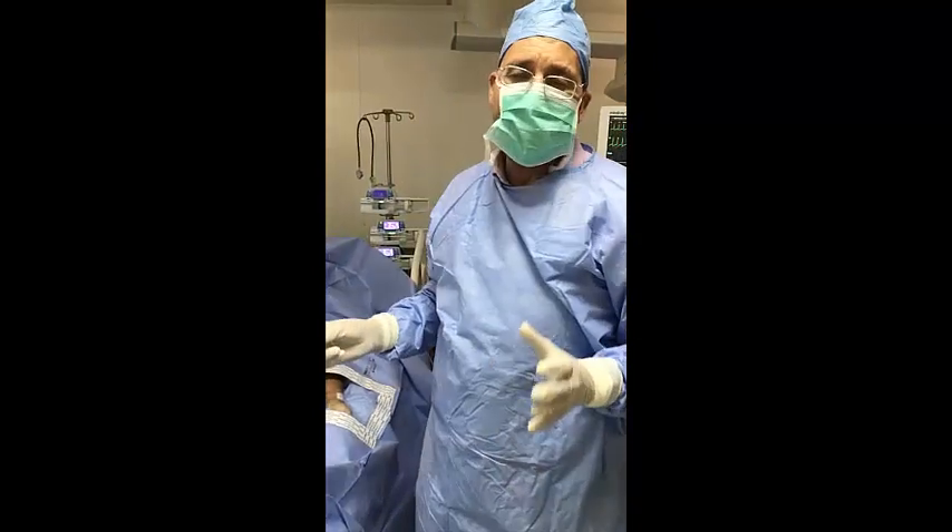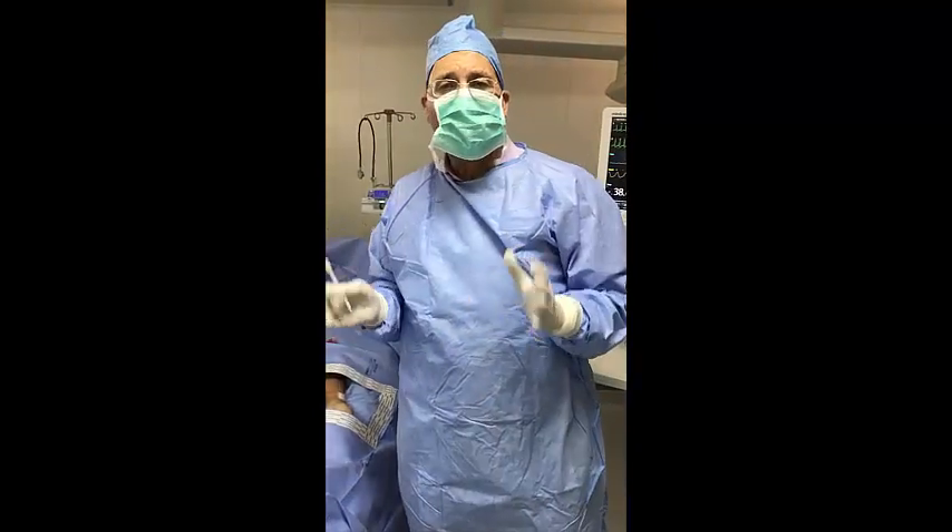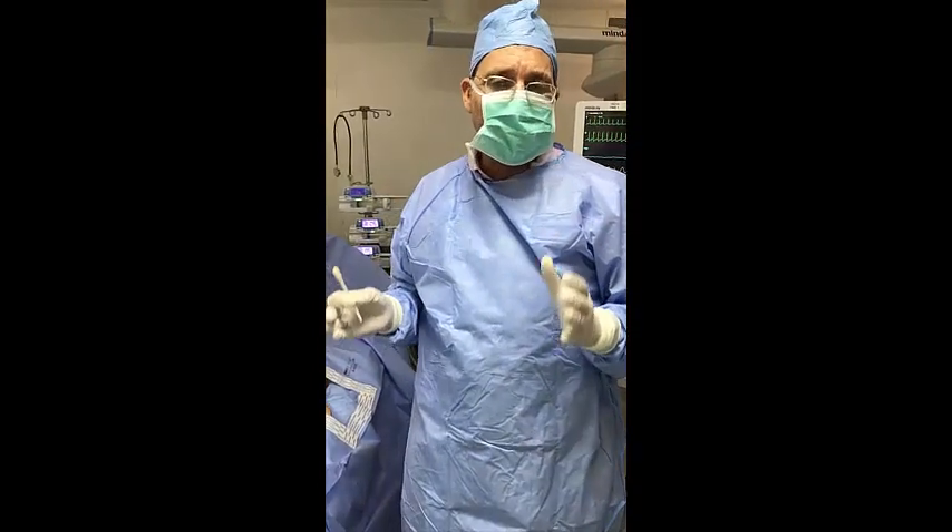Good morning, everybody. I hope this session will help you, insha'Allah, in the proper way to insert an arterial line under ultrasound guidance.